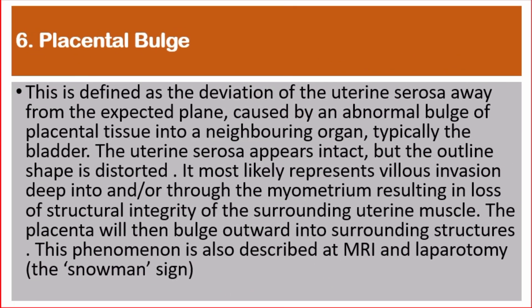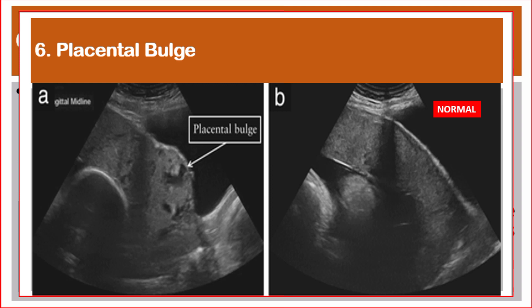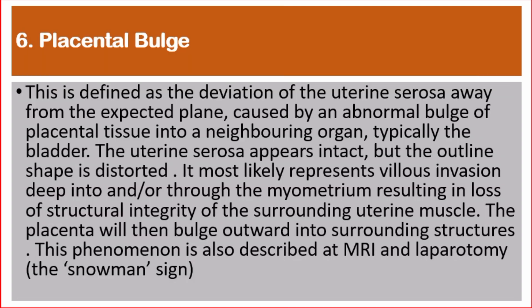Number 6: Placental bulge. This is defined as the deviation of the uterine serosa away from the expected plane, caused by an abnormal bulge of placental tissue into a neighboring organ, typically the bladder. The uterine serosa appears intact, but the outline shape is distorted. It most likely represents villous invasion deep into and/or through the myometrium, resulting in loss of structural integrity of the surrounding uterine muscle. The placenta will then bulge outward into surrounding structures. This phenomenon is also described at MRI and at laparotomy as a snowman sign.